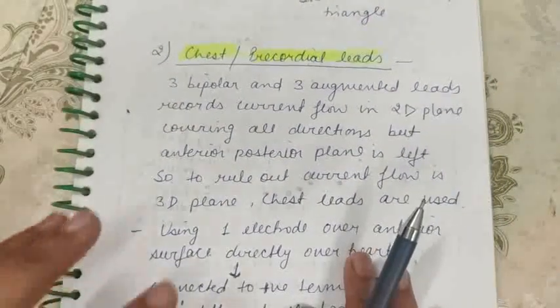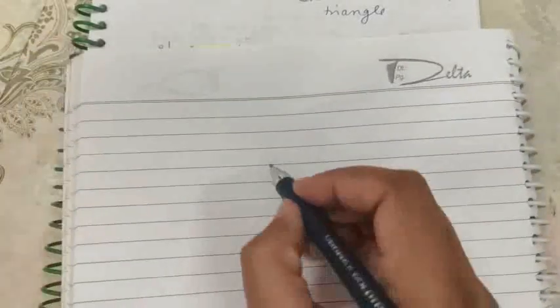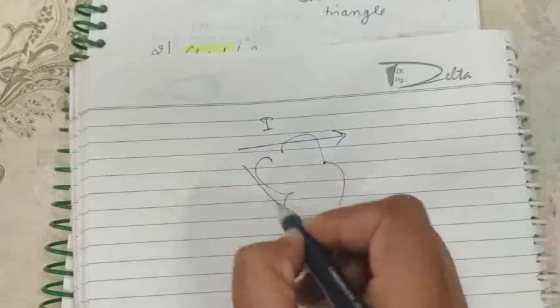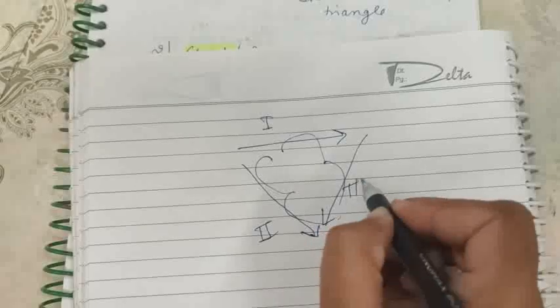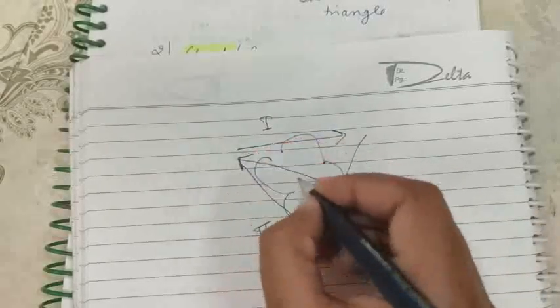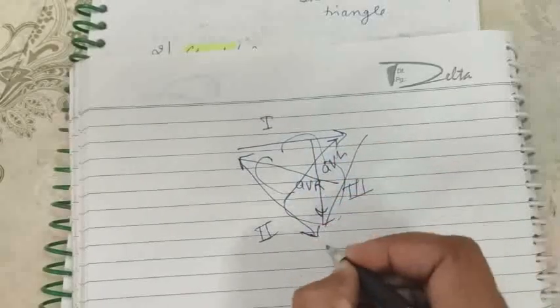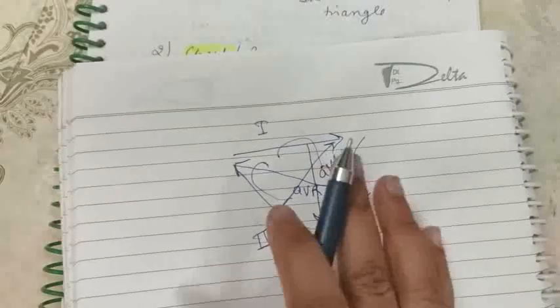So what happens basically in a two-dimensional plane? If you talk about heart at center, if you assume this is heart, right? So what you have done? You have measured in this plane as lead 1, right? You have measured in this plane as lead 2. You have measured in this plane as lead 3. So cavity is missing here. So you have measured in this plane as AVR. You have measured in this plane as AVL. You have measured in this plane AVF. Okay, so approximately two-dimensional plane of heart activity we have captured.